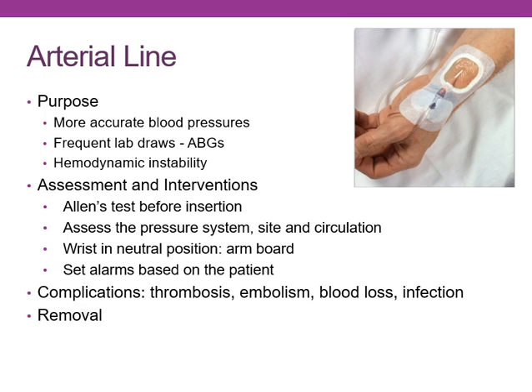So you're going to hold pressure on this site. You're going to put a dressing on it. Think about the fact that you probably don't want to wrap a dressing all the way around it like 4 times after you've taken it out because you've put a tourniquet on. You need to assess circulation here. When you have an arterial line, you do need to assess distal perfusion.